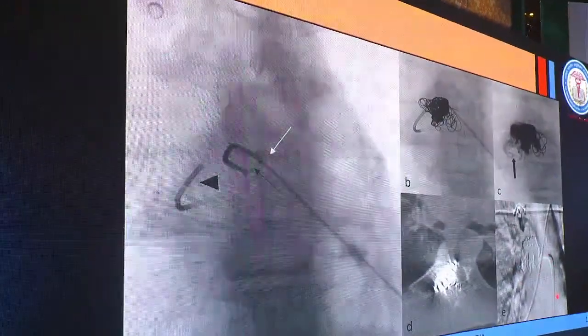So what we did actually was, when the patient was supine, we hooked the most prominent feeder to the fistula. In this case it was right D7. So we placed the diagnostic catheter only at the right D7, and then we clamped the catheter. We sutured the catheter in place on the thigh of the patient. We turned the patient to the prone position, and from the posterior aspect, we directly punctured the fistula through an IV cannula and then embolized the fistula.